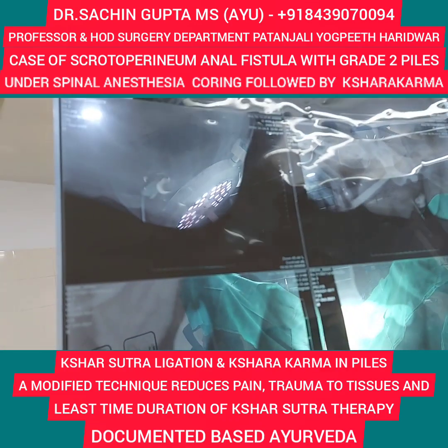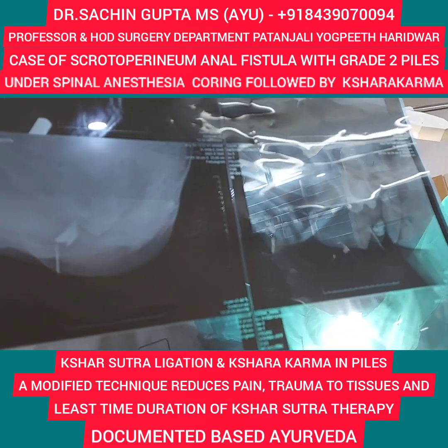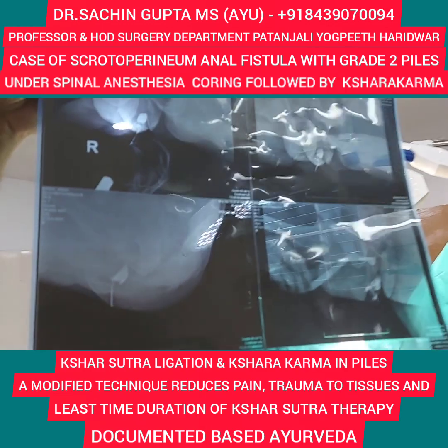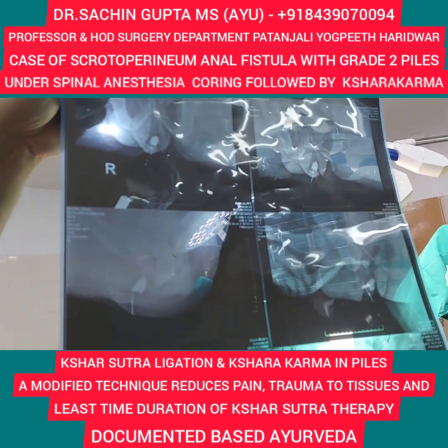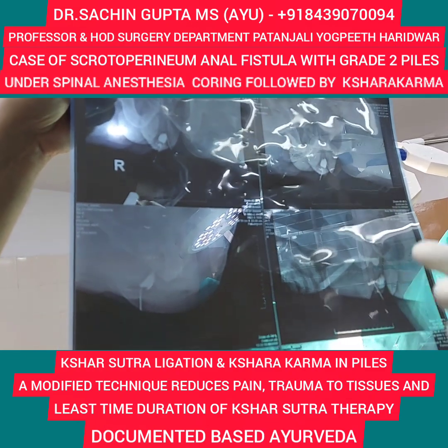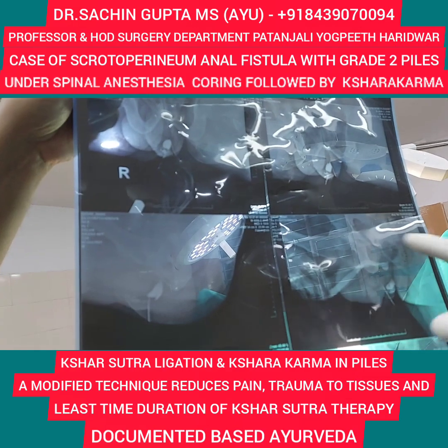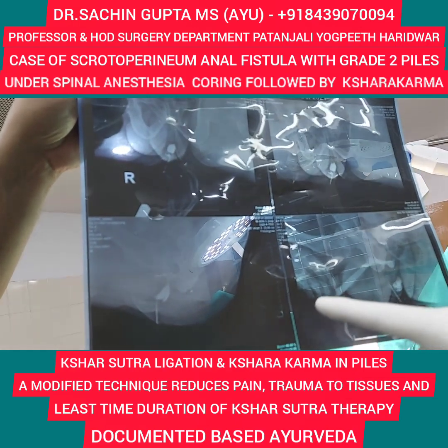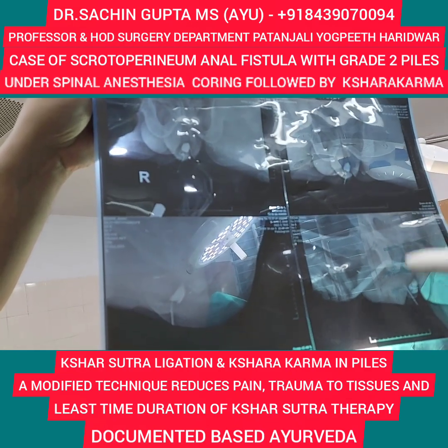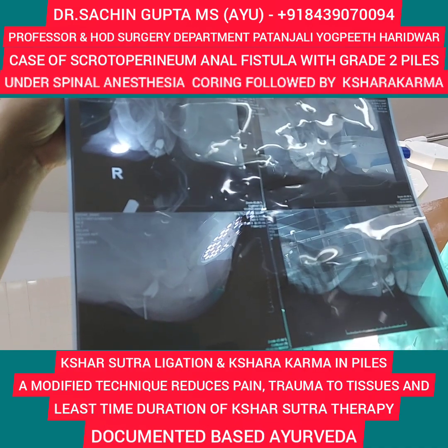RGU is very important wherever the fistula is in the scrotal, that is the penile to scrotal part and the scrotal to perineum part, because sometimes some fistulas are attached to the urethra also. So in this RGU, you can see that there is a clear urethra. There is no stricture, there is no branch, and we are now proceeding towards the procedure.